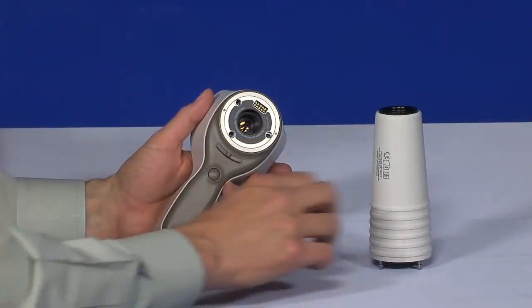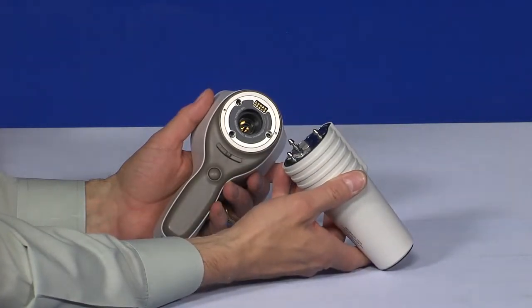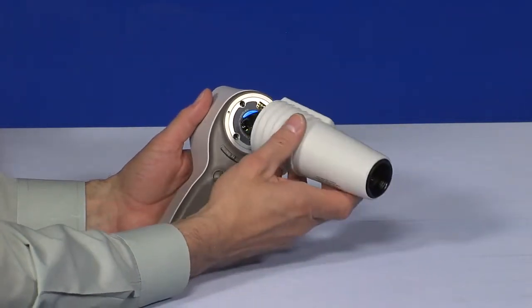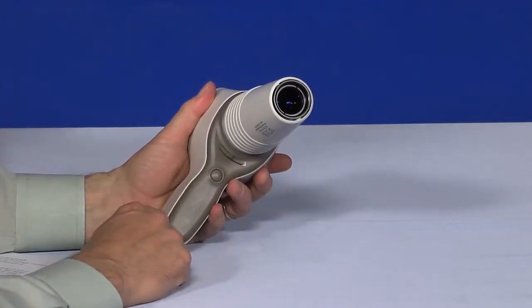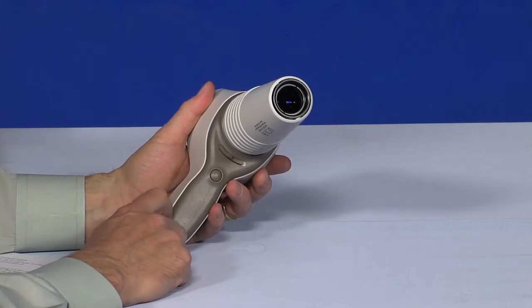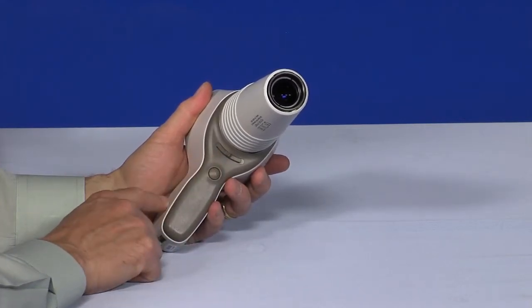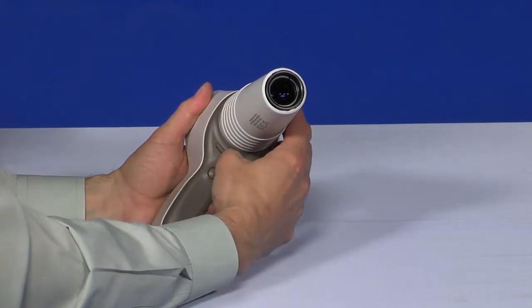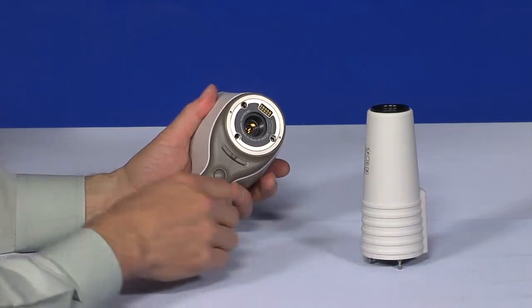Each module is attached by placing it in front of the bayonet area of the device. Three bayonet legs are placed in the holes and the module is pressed firmly into the handset until it clicks into place. A photo or video is captured by using the shutter button. The module is released by sliding the release button located in the front of the device above the shutter button.